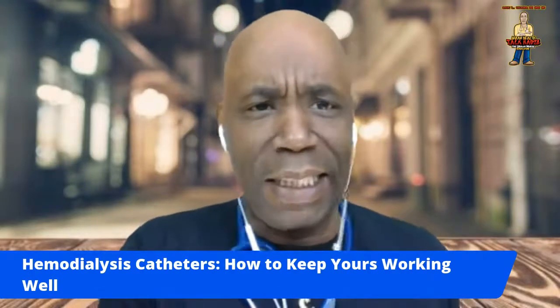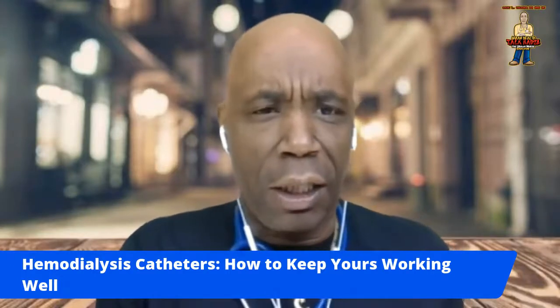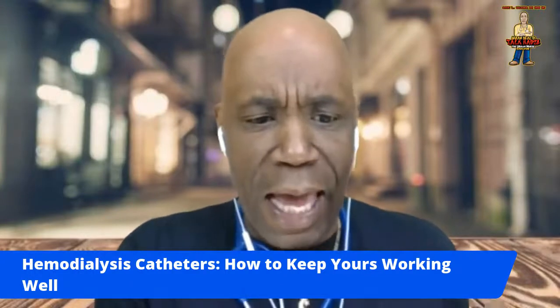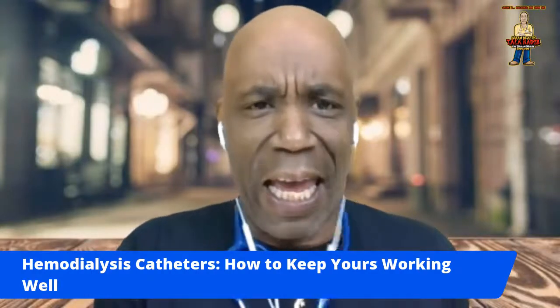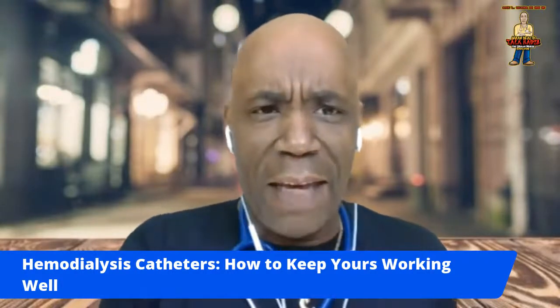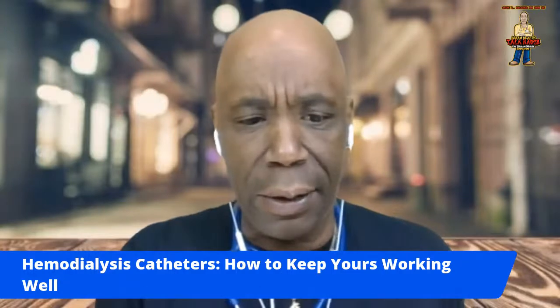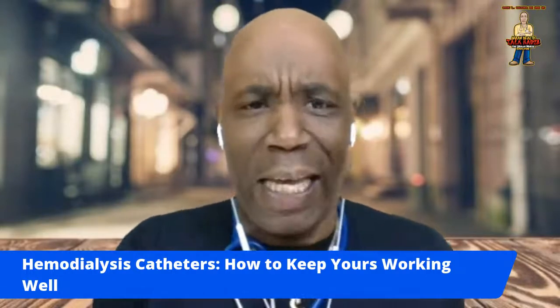Now, let me just say this. The AV fistula, which uses your artery and your veins, is the preferred access of choice as far as permanent access placement. That's the AV fistula because it's using your own veins. Then the AV graft, arterial venous graft, is the next preferred choice for a permanent access. The catheter is only recommended for temporary access.